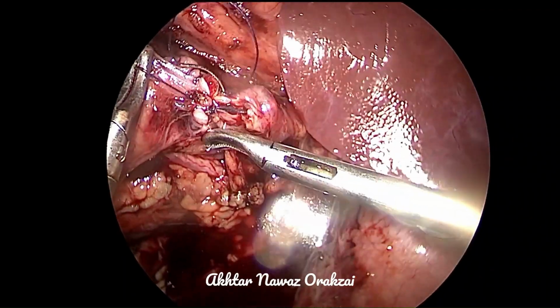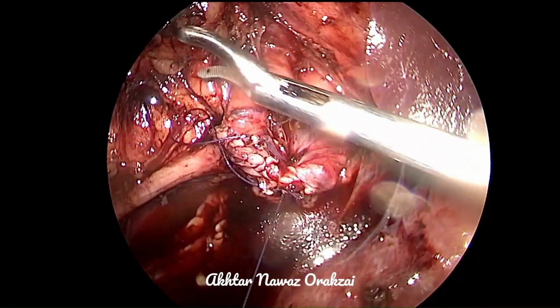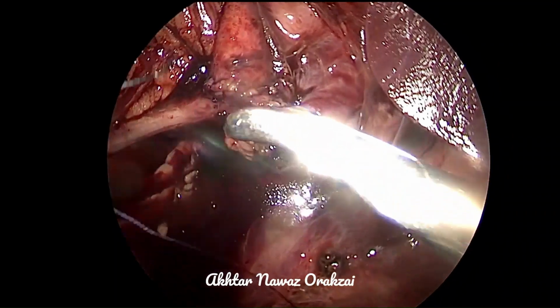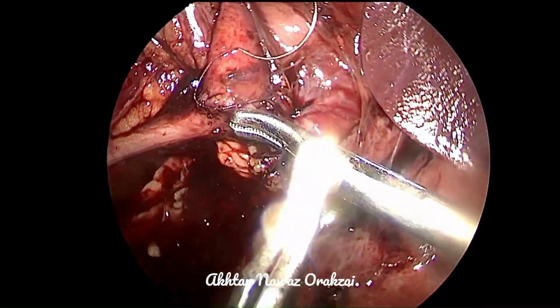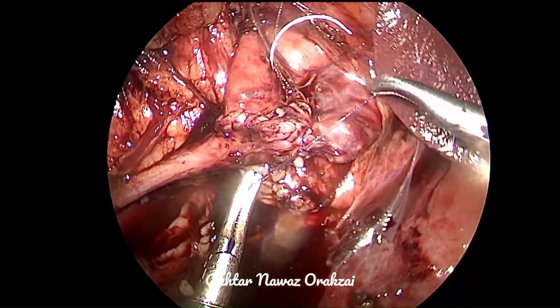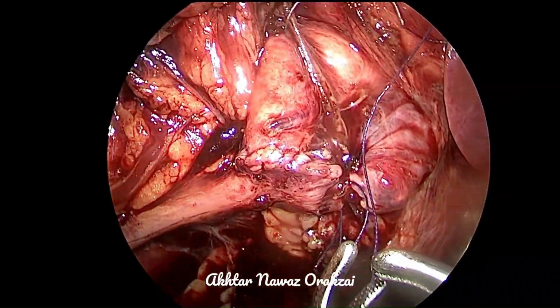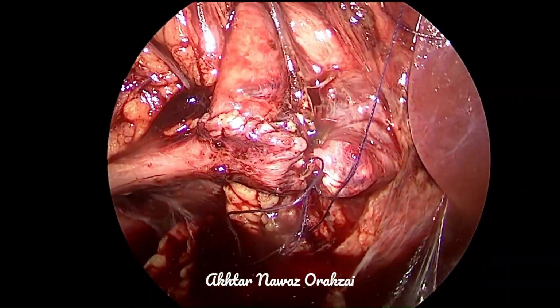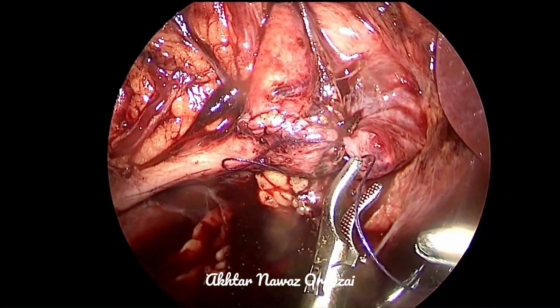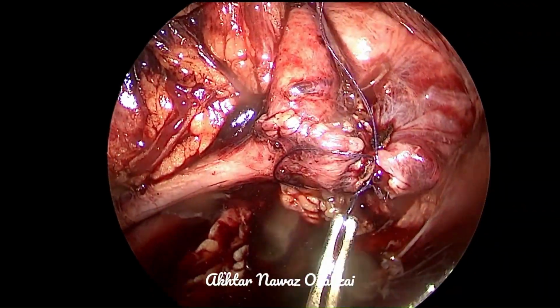Now is the area of the pelvis. The difficult part of the anastomosis is already over. Now is the easy part. One can continue to go towards finishing of the anastomosis with the same suture without tying. However, tying provides an extra strength.